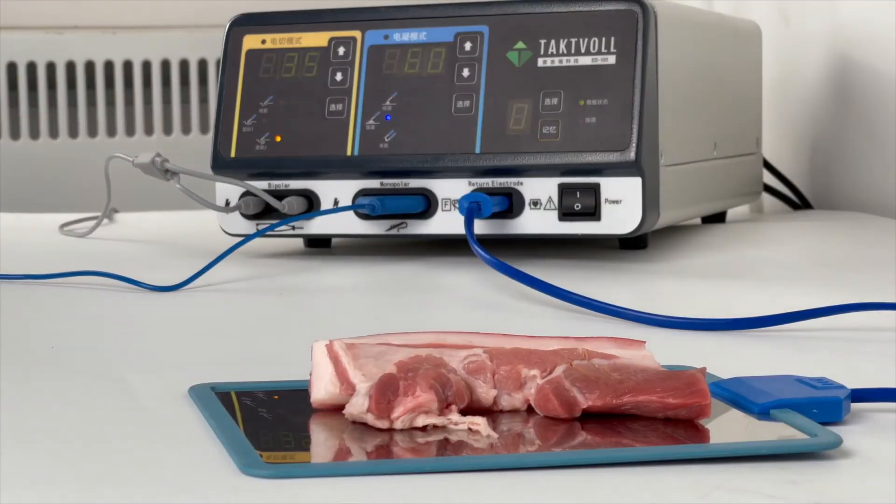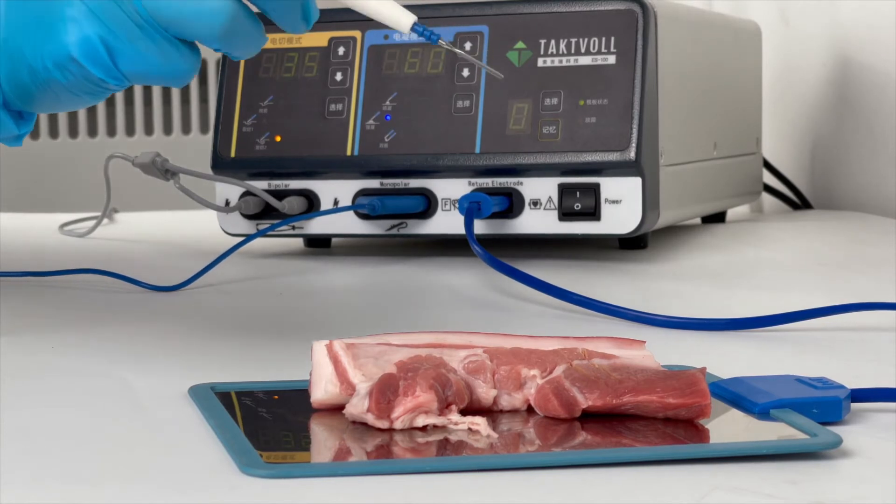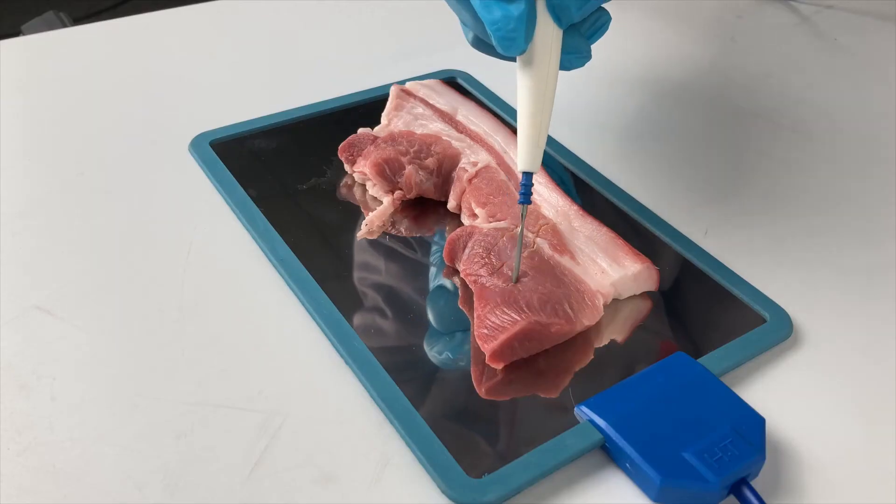Similarly, in the Blend 2 Mode, the power is still 35. The coagulation effect will be stronger.